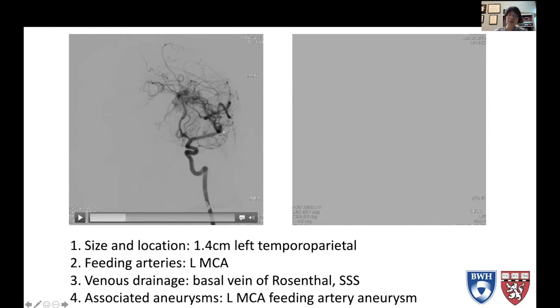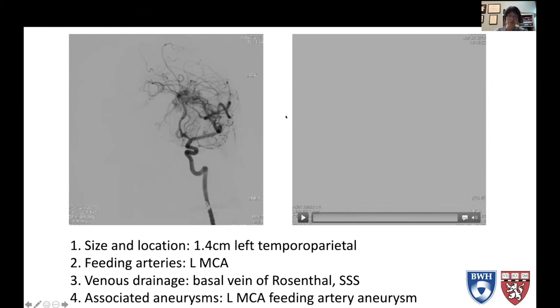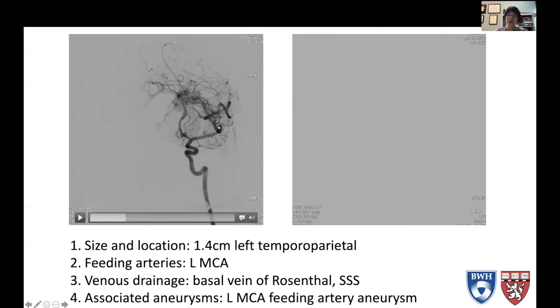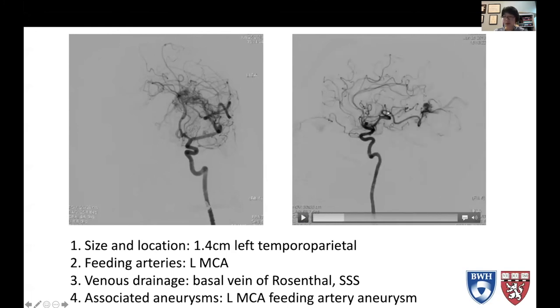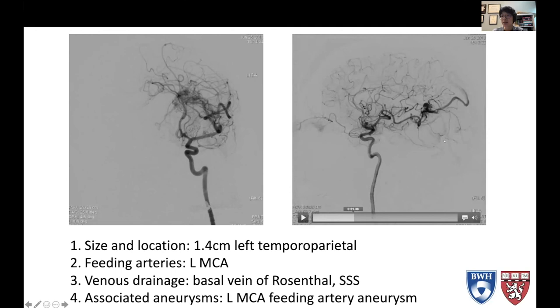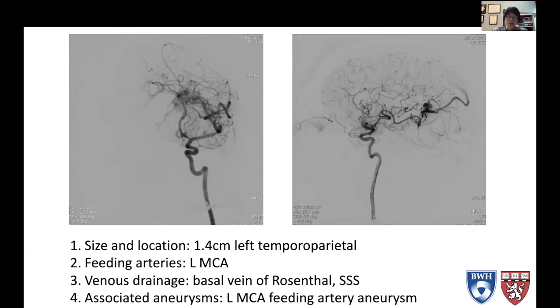Because of this high flow, many AVMs are associated with what's called a feeding artery aneurysm. Here we have a middle cerebral artery aneurysm — it's considered a feeding artery aneurysm to the AVM. On the lateral view, you can see the AVM a bit better, with the MCA feeding it. You see the draining veins right in the middle of the arterial phase, draining into the superior sagittal sinus and into the basal vein of Rosenthal, vein of Galen, and straight sinus — the deep venous system. So I would describe this as a 1.4 centimeter left temporal parietal AVM fed by left MCA branches, with drainage into the basal vein of Rosenthal and superior sagittal sinus, and an associated left MCA feeding artery aneurysm.